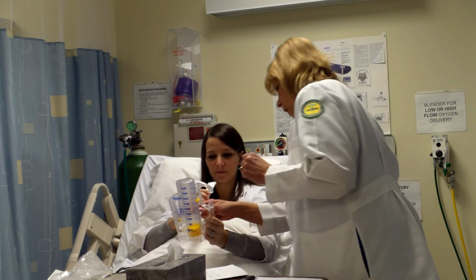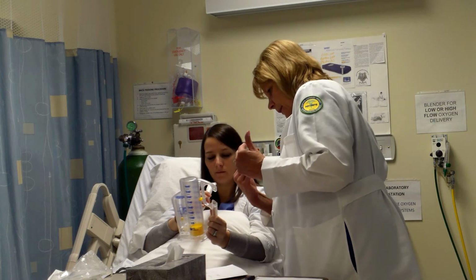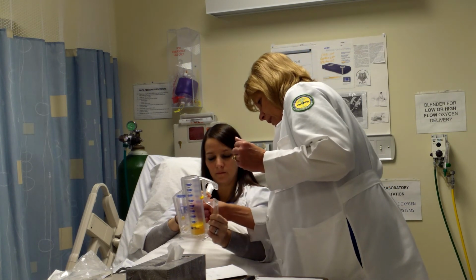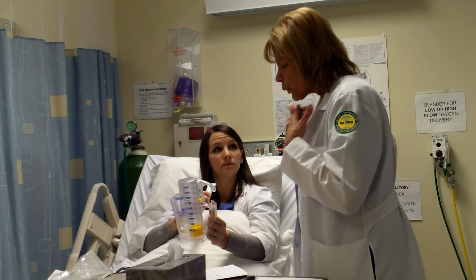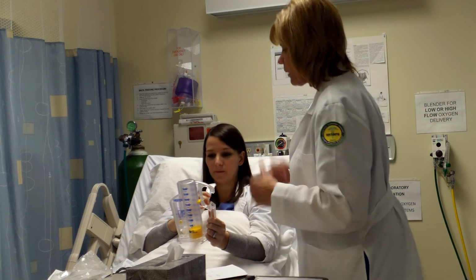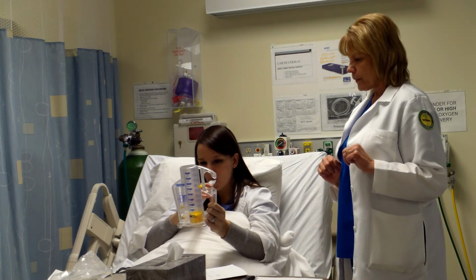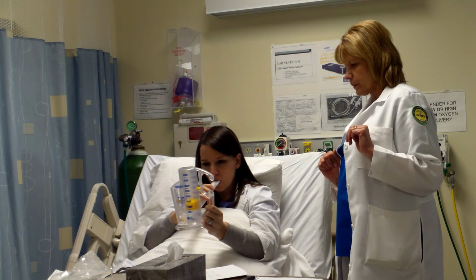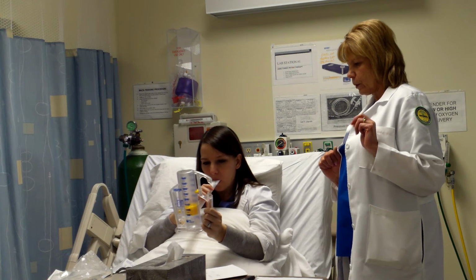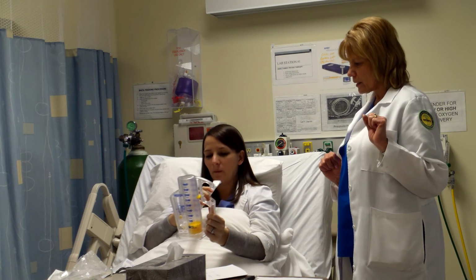Okay. I want you to watch this little indicator as you're breathing, and when you breathe in, see if you can get it to stay in that little box. Okay? So that means you're breathing in at the right speed. All right, so exhale normally. Put the mouthpiece in your mouth. Slow, deep breath. That's great. Keep going, keep going. Hold it, hold it. Take the mouthpiece out of your mouth. That's it.